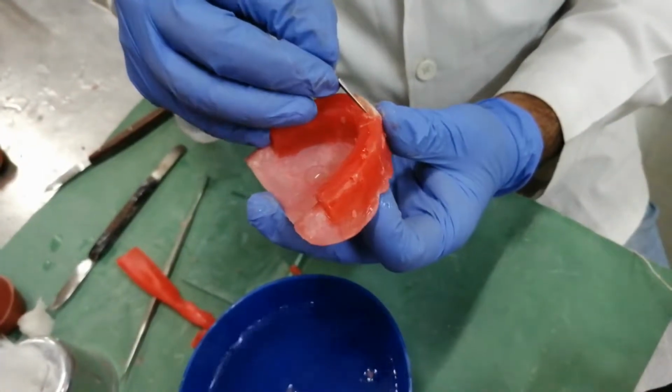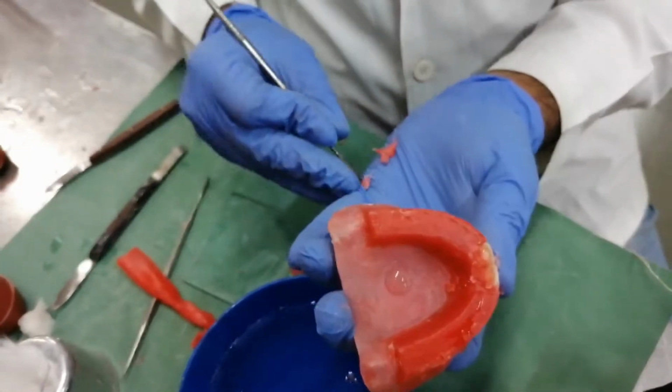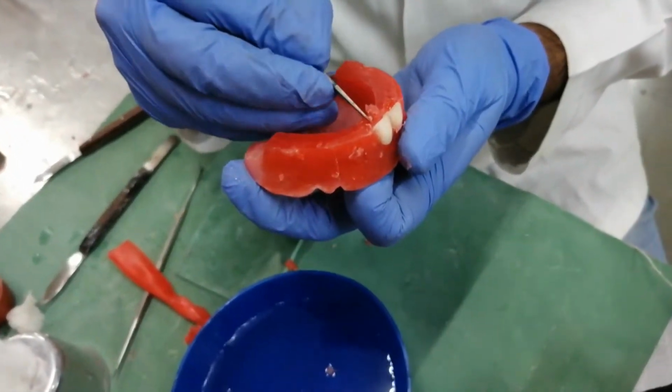See from the palatal aspect how much teeth are visible. You have to take out only this much amount of wax.